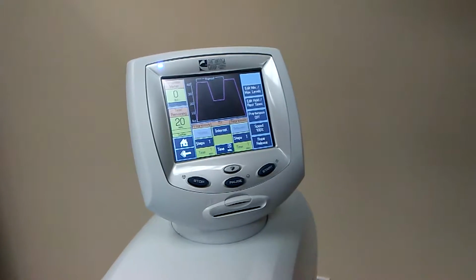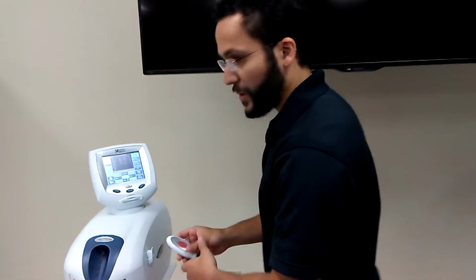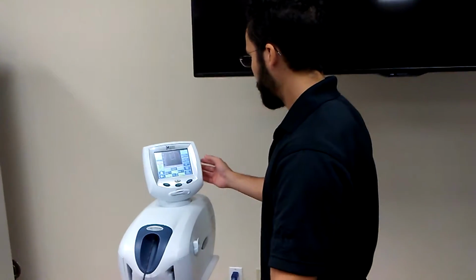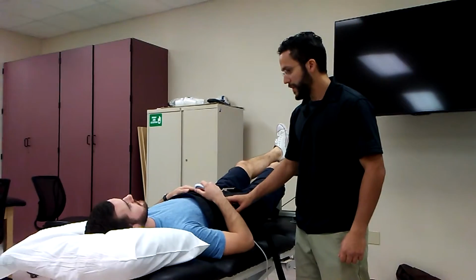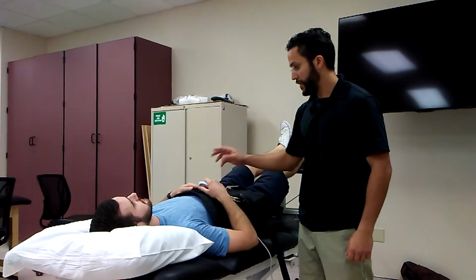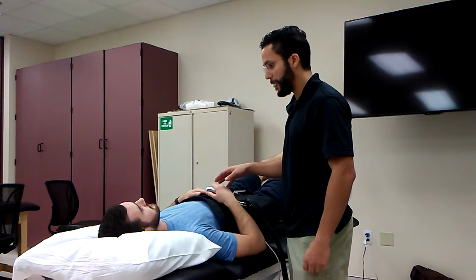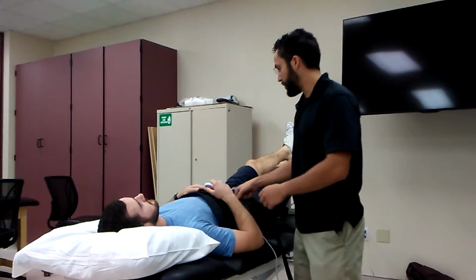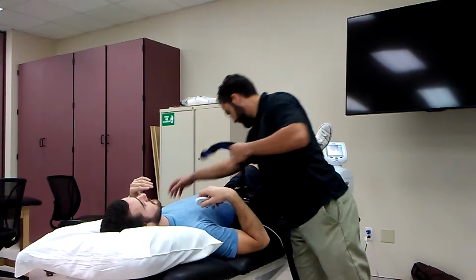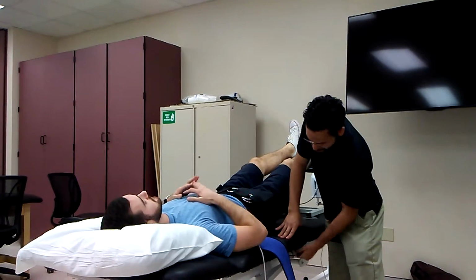Now we give the emergency button to the patient. Treatment, I'm going to check the patient, see if he's okay. Educate him just to make sure that he has the call bell, so he can press the button to stop the machine. And now since the treatment is over, I'm going to unstrap him, lock the table up.